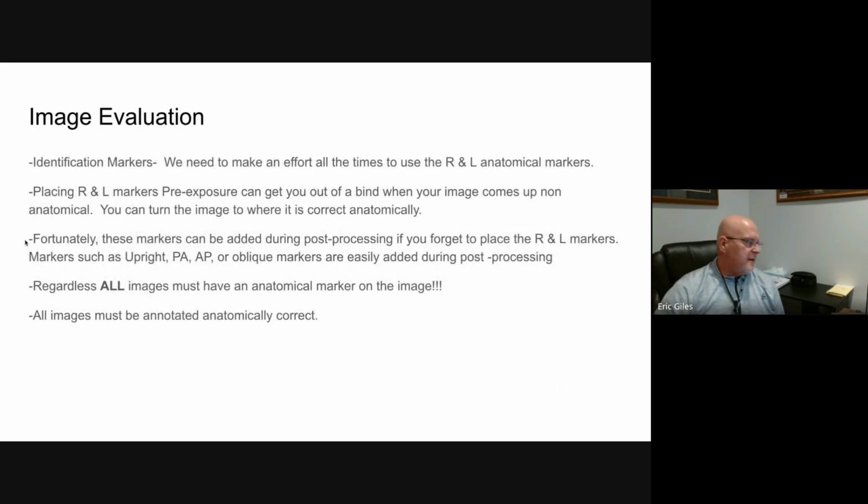Hey, so identification markers, it's like we're beating a dead horse, but we need to make the effort to use our right and left markers. And I'm guilty of this. I get going and I'll forget to put a marker on there. I'll just do it post-processing, but that can come back and bite you in the behind. I think that we should use our left and right markers. If you don't have markers in your clinic, let us know, we'll get you some. Just mark the side of the body that you're doing with those markers, and that way you're never going to have an issue.